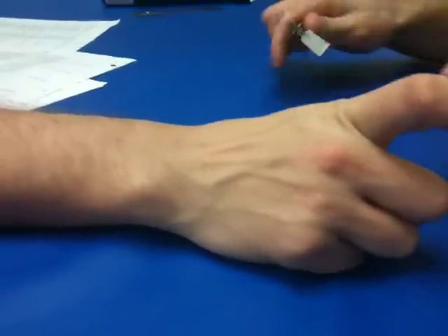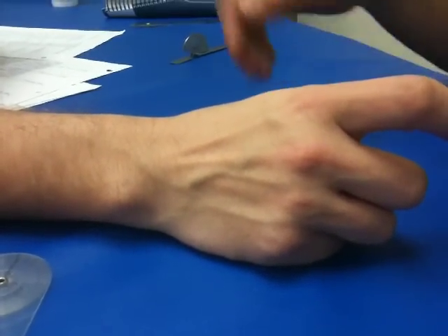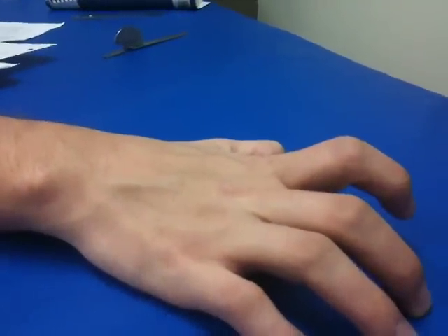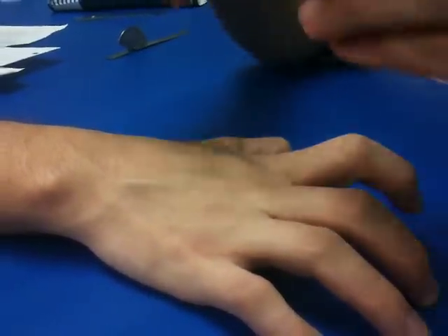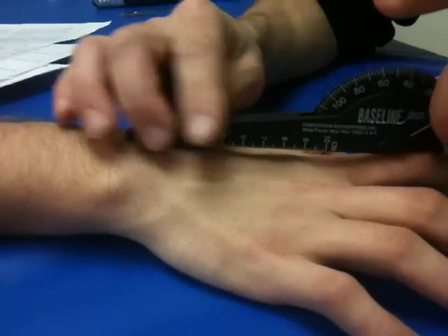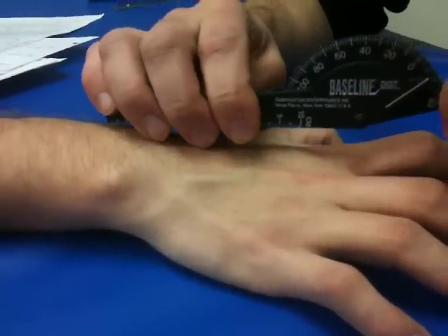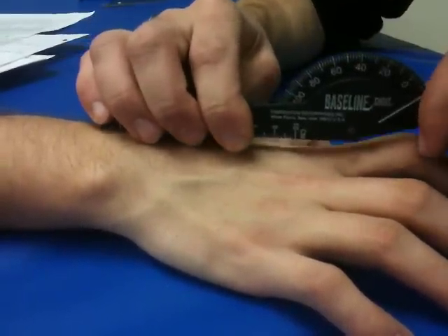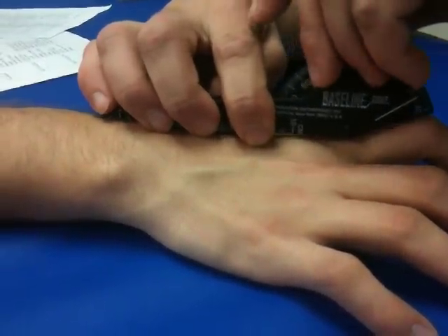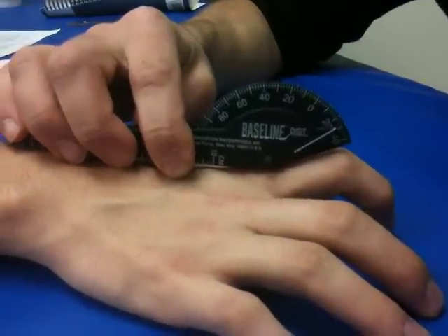How about extension at the MCP joint? Give me the same landmarks. Fulcrum over the MCP joint, stationary arm over the midline of the second metacarpal, moveable arm over the midline of the second phalange. And extend — just follow it up. Normal is 0 to 45, and here it is at 45 degrees.